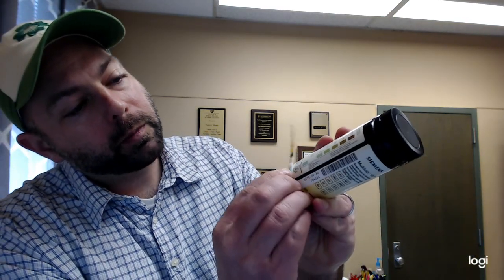So what I would do, for example, if I wanted to read glucose, is after 30 seconds, you can see it says 30 seconds right there, I would compare this bottom tab, and we can see it's closest in color to this first box there, this one right there, so it's negative. This one doesn't have any glucose in it, which is good because it's water from the water fountain.